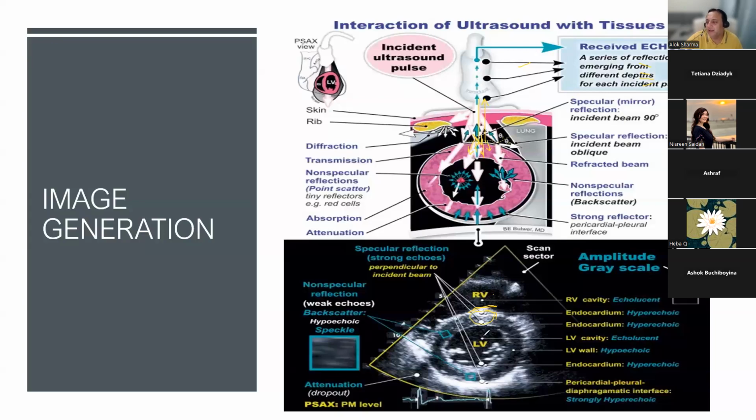And then suddenly, you've got a heart which is full of blood. Now, we know that the density of blood is much less than the density of tissue. So sound waves will travel slowly here. They'll lose energy, they'll attenuate. So you get this hypoechoic region. But really over here, the sound waves will pass through without any problems. There won't be much reflection at all. And because they pass back without any kind of reflection and increase in their propagation velocity, there is not much reflection at all. And the sound wave basically gives what we call an anechoic image because it's fluid. So fluid tends to give you that anechoic kind of image.